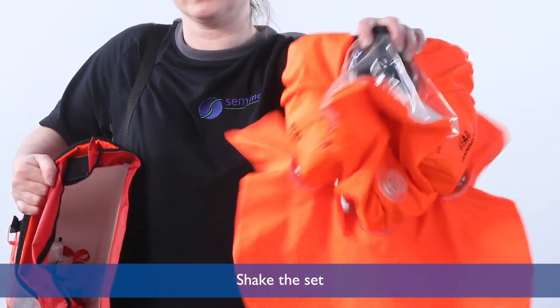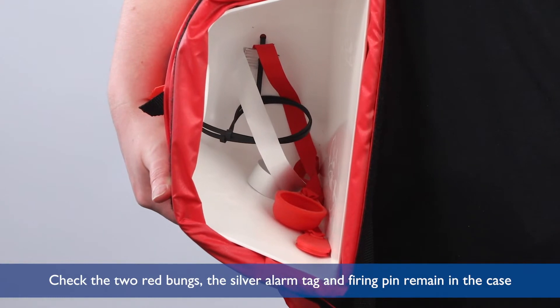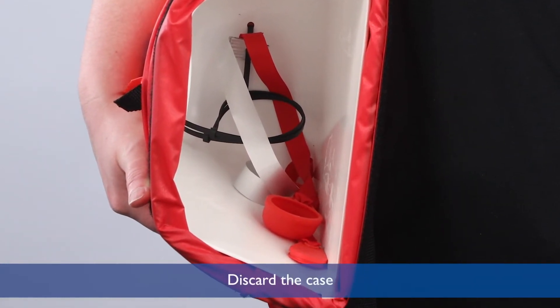Shake the set. Check the two red bungs, the silver alarm tag, and firing pin remain in the case. Discard the case.